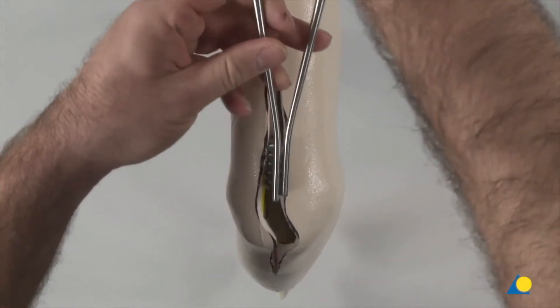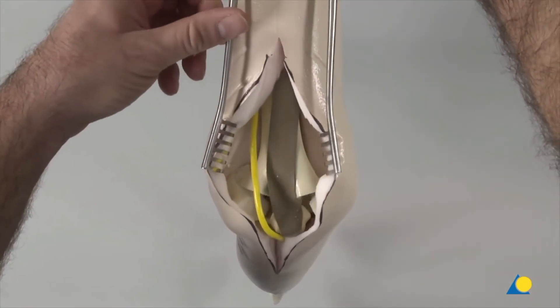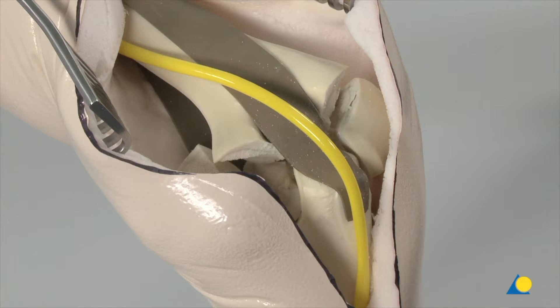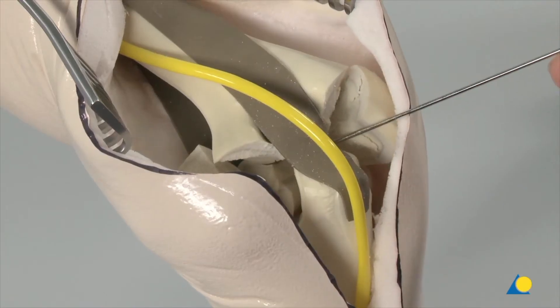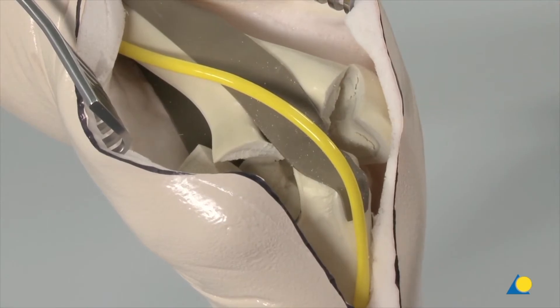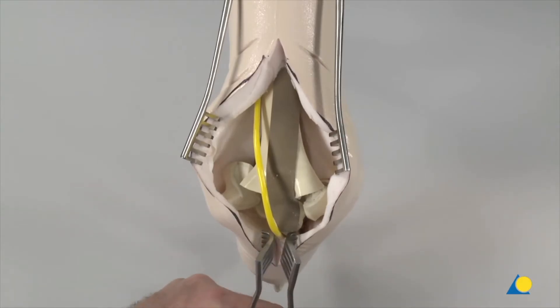The self-holding spreaders are inserted to hold back the soft tissues. The fracture of the distal humerus is visible with a proximal diaphyseal-metaphyseal fragment, an ulna fragment, a radial fragment, and an intermediate fragment. The next step will be to perform an osteotomy of the proximal ulna in order to visualize the intraarticular component.